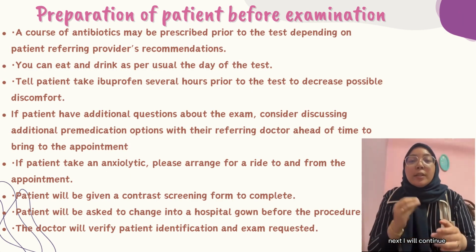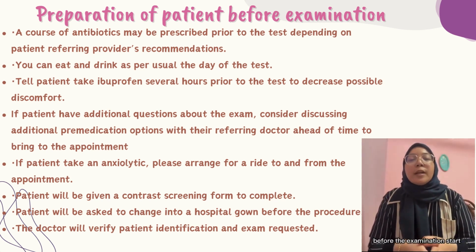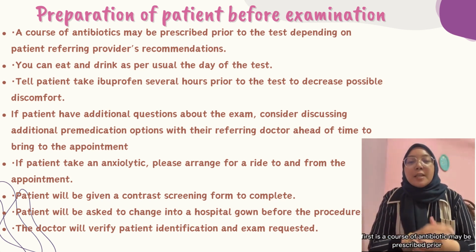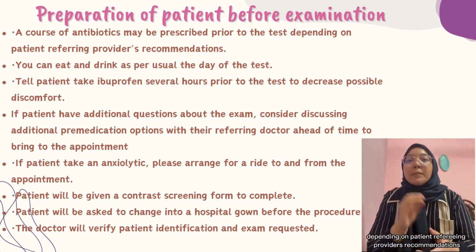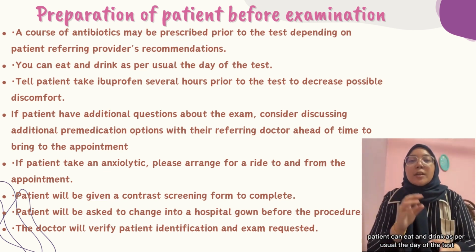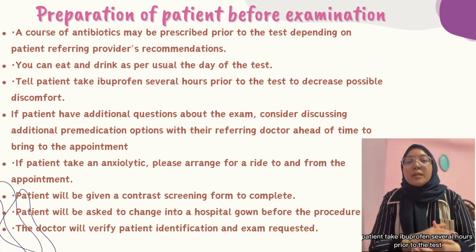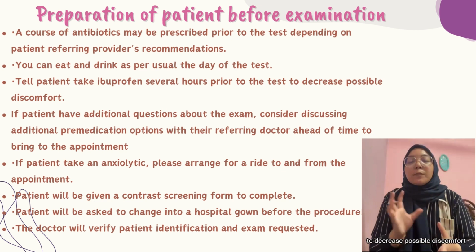Next, I will continue with the patient preparation needed before the examination starts. First, a course of antibiotics may be prescribed prior to the test depending on the referring provider's recommendations. Second, the patient can eat and drink as per usual on the day of the test. Third, tell the patient to take ibuprofen several hours prior to the test to decrease possible discomfort.